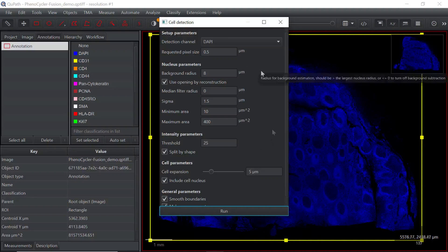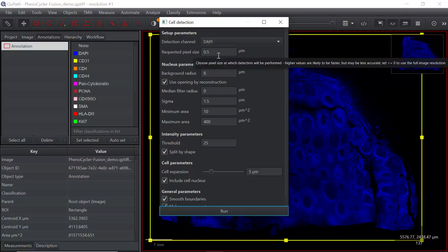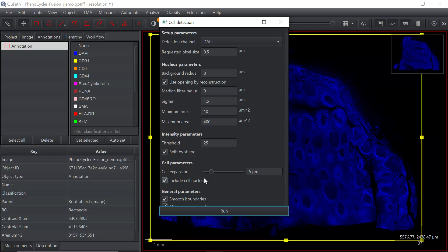A new window pops out. For today's demonstration, we can keep all the default settings, though you can change them. For example, you can change the requested pixel size — currently set to 0.5. Available settings include 0.37, 0.33, and 0.25. Setting a smaller pixel size will take longer to analyze. You can also change the cell expansion size, which depends on your dataset. Let's keep the current settings and run cell detection.